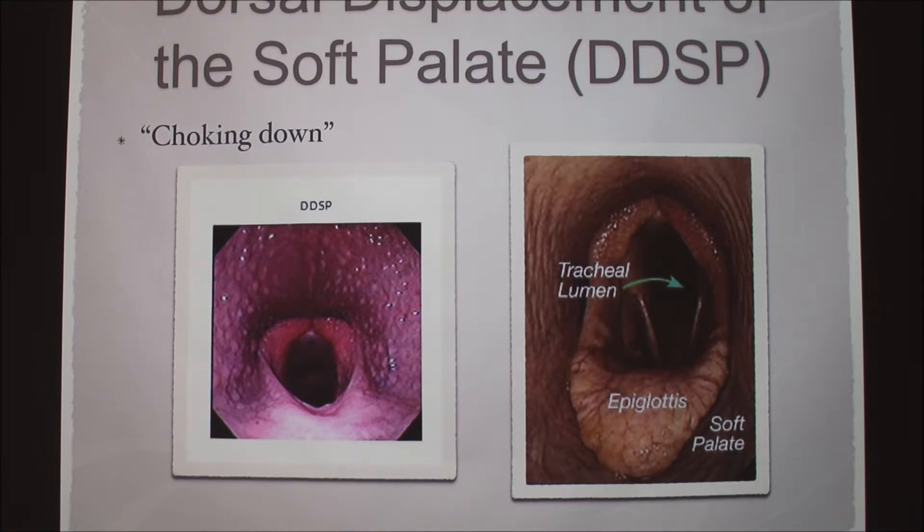The other thing they look for is dorsal displacement of the soft palate. We refer to this as choking down — the exercise rider might say 'this horse is choking down on me.' It's most commonly heard at the end of the race when they're breathing the hardest. The soft palate actually gets flipped up completely over the epiglottis, so you can't see the epiglottis at all. When the horse exhales, the trachea gets completely blocked, so it sounds like they're choking. Towards the end of the race, the horse is running well and then just hits a switch and shuts down.